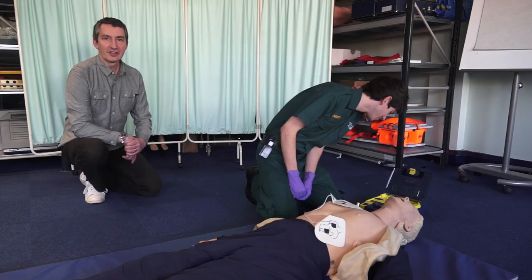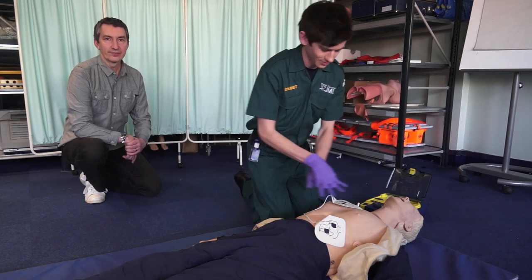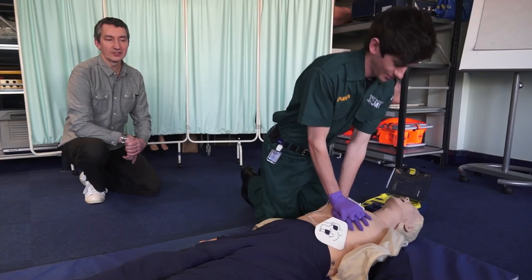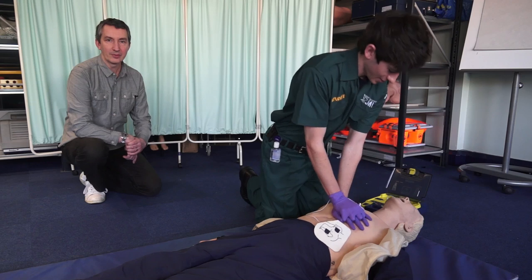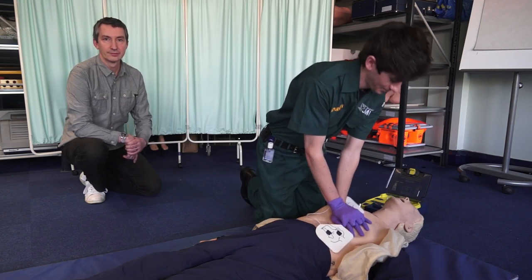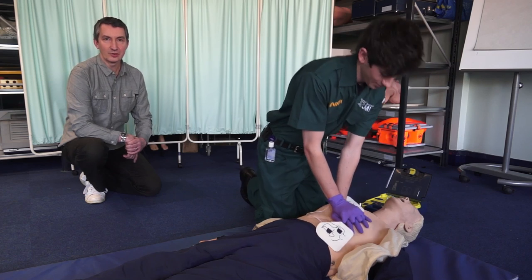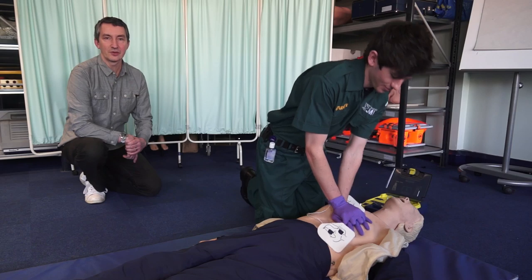Once the shock's been delivered, we need to then start doing cardiopulmonary resuscitation. This means placing our hands in the centre of the chest and compressing about 120 a minute to a depth which is about a third of the patient's chest depth. This will continue for approximately two minutes or until the AED tells you to stop whilst it reanalyses.